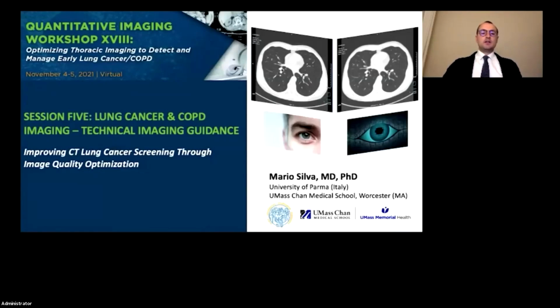I hope again this was an opportunity to give you some points for discussion. Of course, a drawback of the proposed reconstruction and reading method is that the volume of storage is going to be a bit larger than compared to a single reconstruction. But probably at this point, this might be an option for merging both visual and quantitative reading. And thank you for your attention.